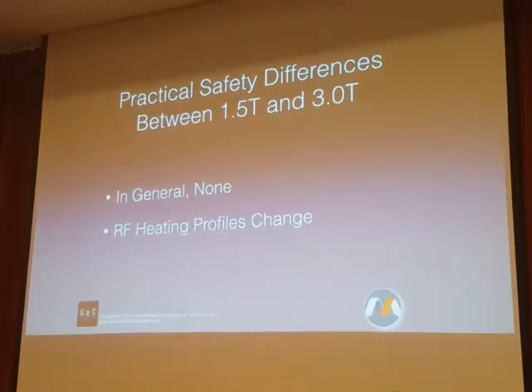As we move into the 1.5 and we get into the 25 to 30 centimeters, now we're concerned about things like, 25 to 30 centimeters is close to the length of a pacemaker lead. It's close to the length of the lead of a deep brain stimulator. Some neurostimulators have lead lengths in the 25 to 30 centimeters.